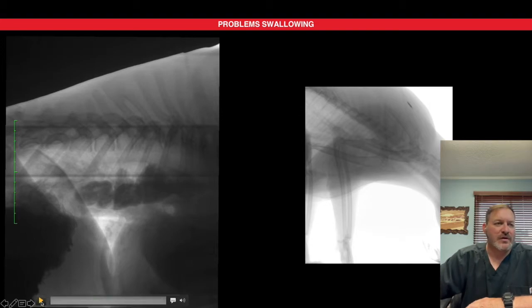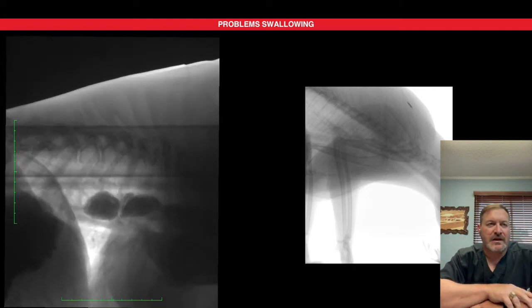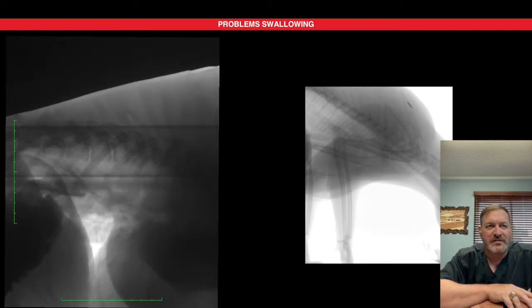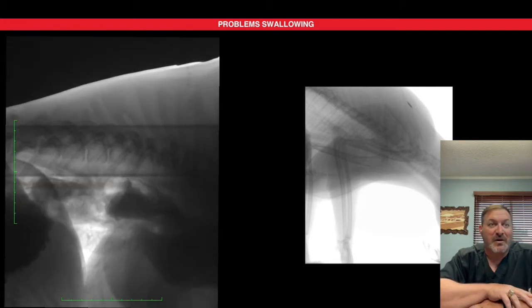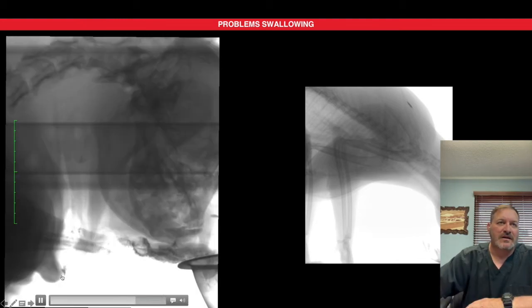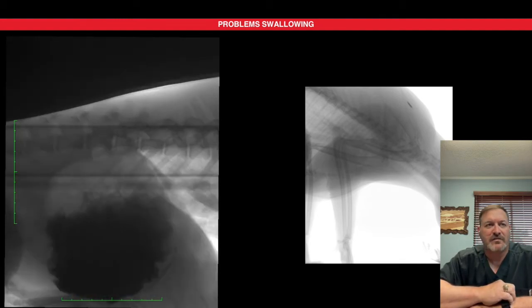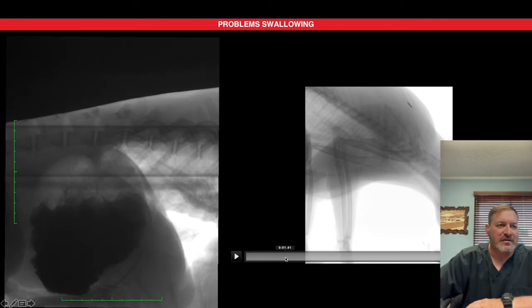And then in this situation, on the left side of the screen, this is a dog that we're looking at as a swallowing situation for a mega esophagus. This dog couldn't hold much down, so we had to determine using contrast imaging, using barium, how the dog swallowed and why there was definite chronic vomiting with this patient. So easy to diagnose. With fluoro, we could see mega esophagus with radiographs, but we can't really see it in action. With fluoro, we can see it in action and get a way better diagnosis and a better indication of what's going on.